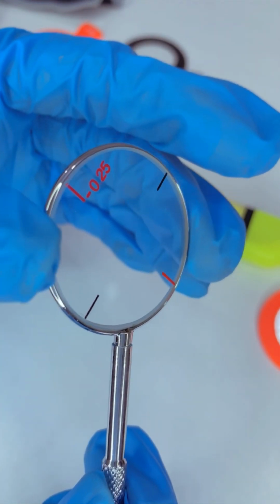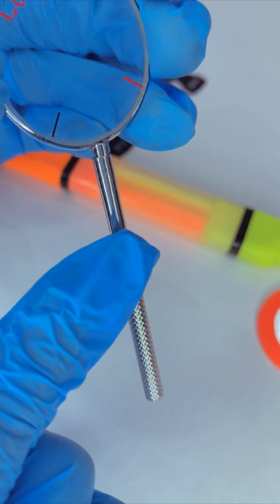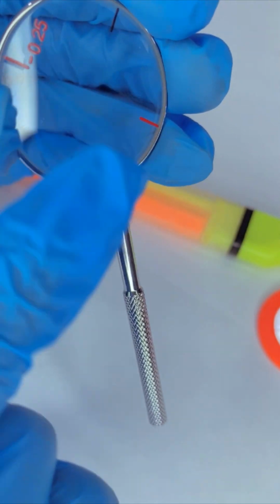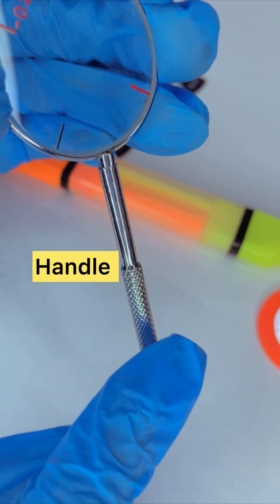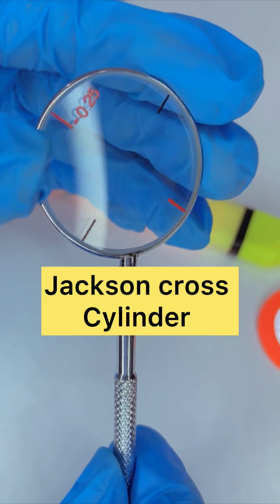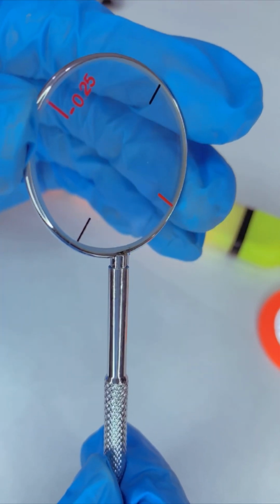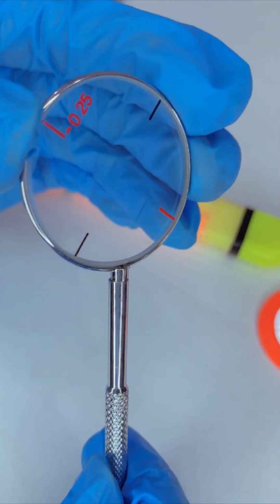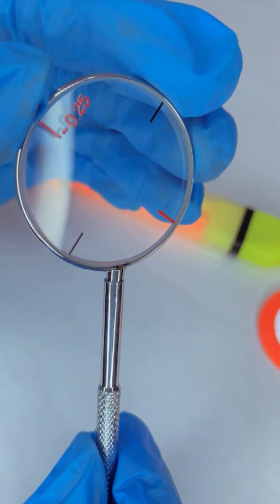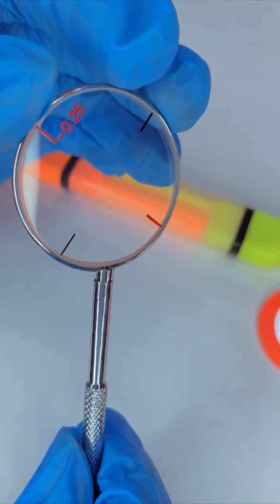The cross cylinder with the handle was then referred to as the Jackson cross cylinder. The person who brought this concept is actually called Jackson. So in fact, that became Jackson's cross cylinder.